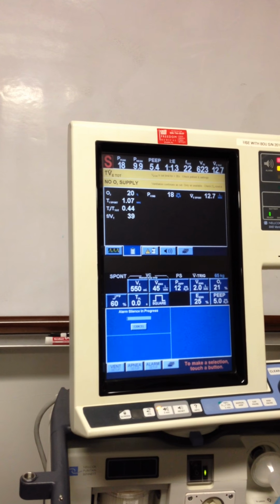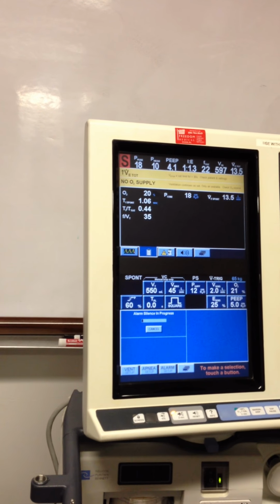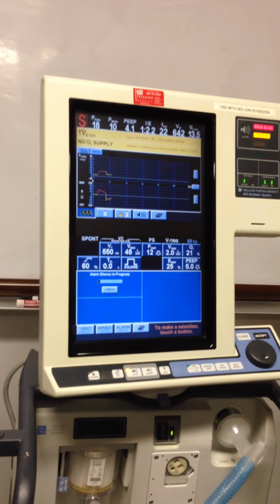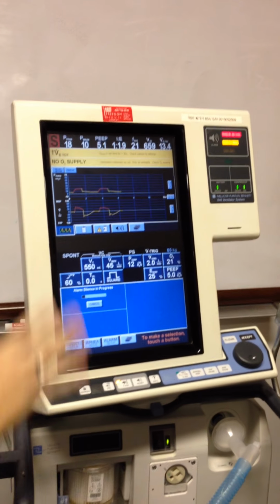Less than what? 105. Yeah. I thought it was 106 or something. The number keeps sticking in my head. What is it? Less than 105. So this, since it is peak compensated, this will be 17, right? Mm-hmm. Just trying to remember.